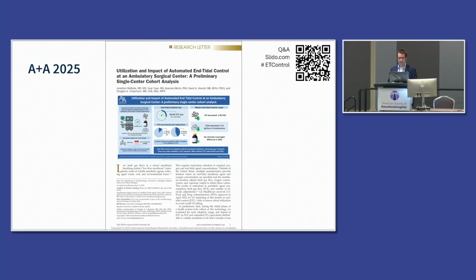What I think we really struggle with as clinicians, and specifically clinicians that are looking to bring in technology to change behavior, is often the real-world claims that are made about equipment don't match up when you throw it into a situation to say, hey, look, is this going to work or not? And it was fascinating that what we saw here was a really quite rapid adoption by providers, and that when it was used, it did exactly what you would expect it to do.